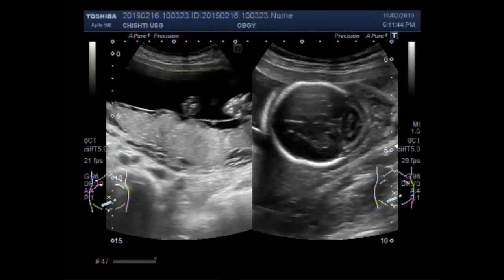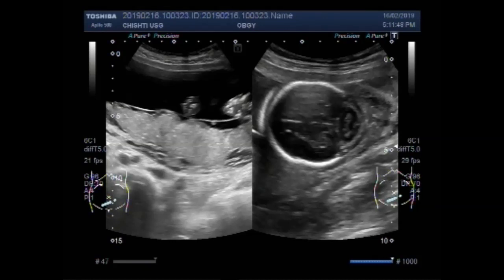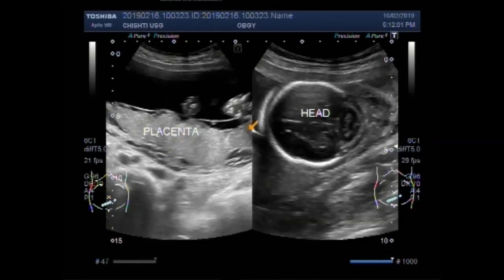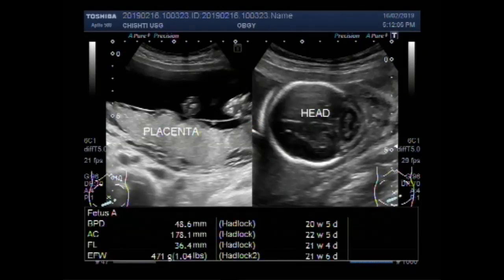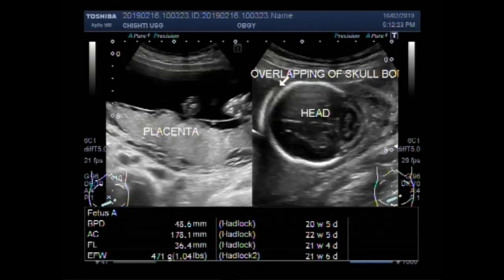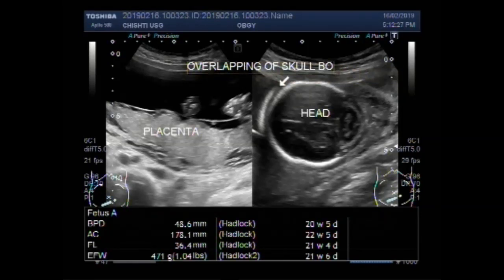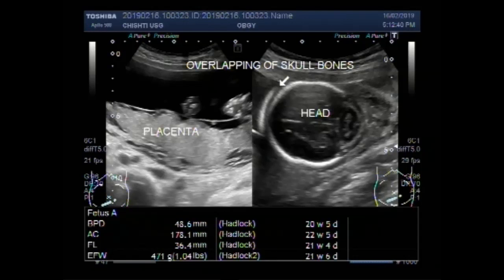You can see the overlapping of the skull bones with soft tissue edema in the hind portion of the skull. This is the fetal head, and this one is the placenta. This is the overlapping of skull bones — that is, the Spalding sign is positive. You can see the fetal age measured by different parameters; the fetus averages 21 weeks, 5 days.